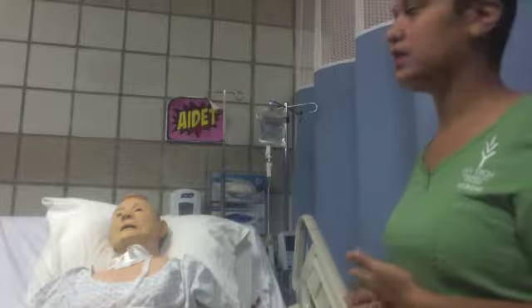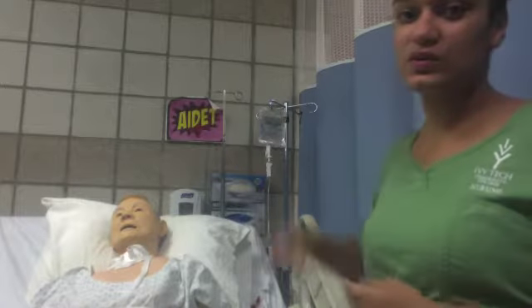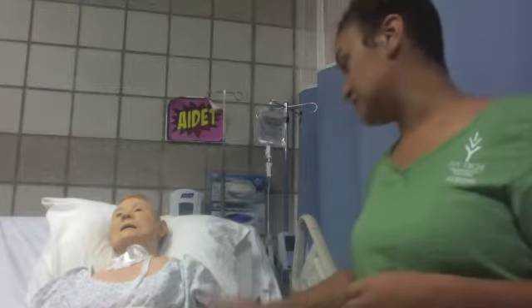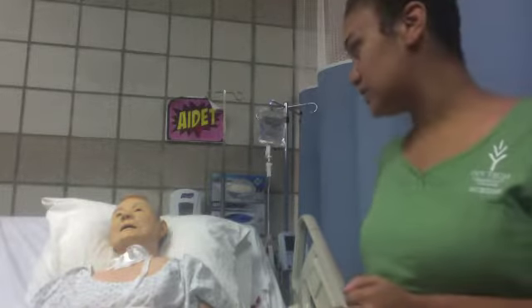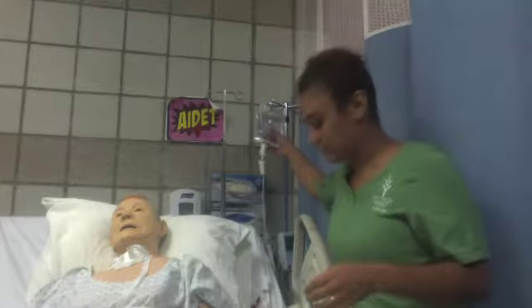So this is the blood administration video. So per my last video, you saw me go ahead and check the IV. The saline was being used, so it's already infiltrated throughout the system. I checked the site for patency. I've already asked about fever, chills, warmth, redness, pus, phlebitis. I've asked about pain. I've asked about all those things in my previous video. I've checked the date of both the infusion set and the bag and all of that.